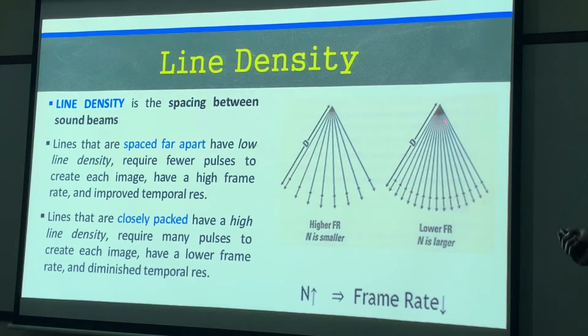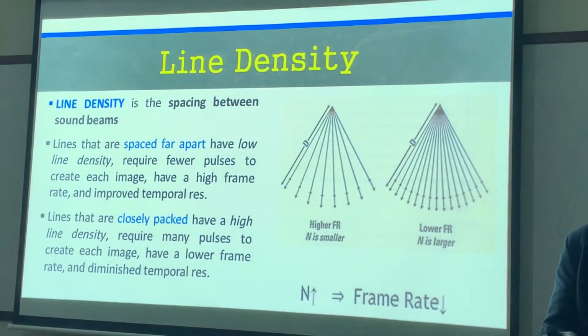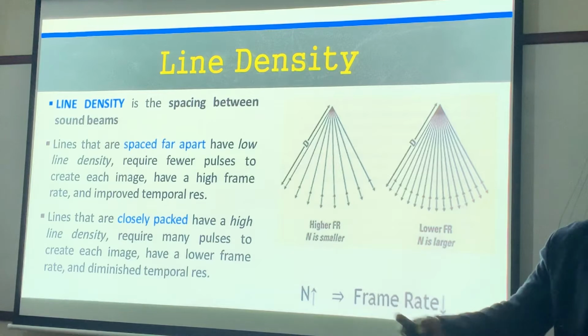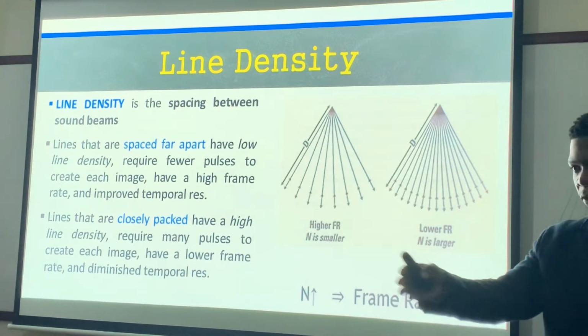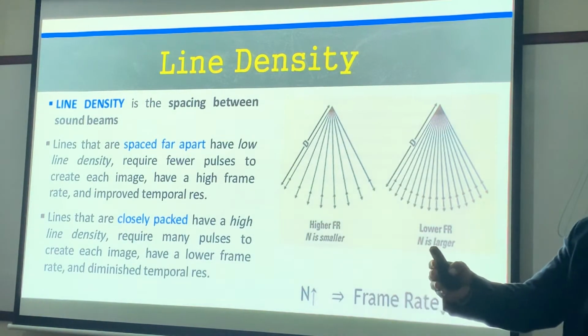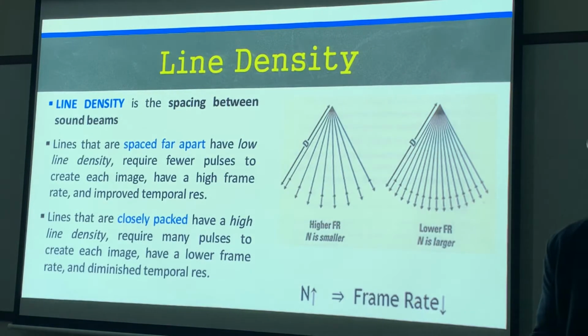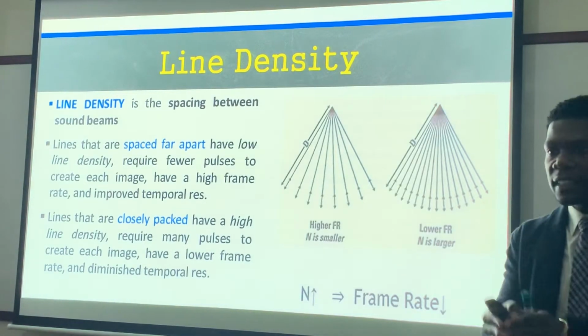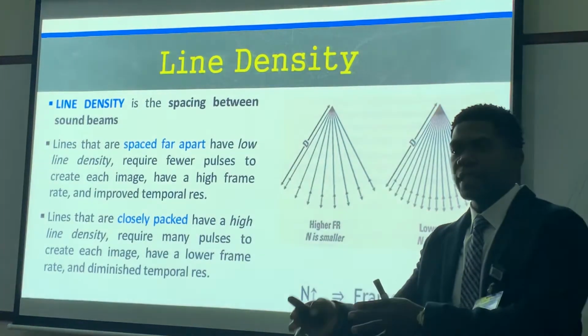I'm missing less information. You know, it's kind of like with a CAT scan. If I'm scanning on my table, and let's say I'm taking an image every 5 centimeters, I'm probably going to be done with that scan a lot faster than if I'm scanning the image every 1 centimeter. But if I'm scanning at one centimeter per image, then I'm getting a lot thinner slices, meaning I'm getting a lot more accurate information, right?